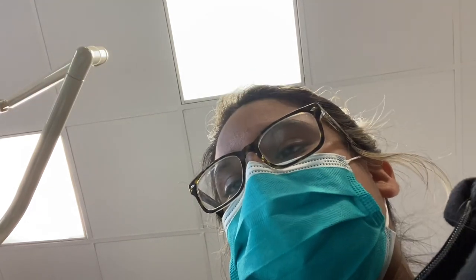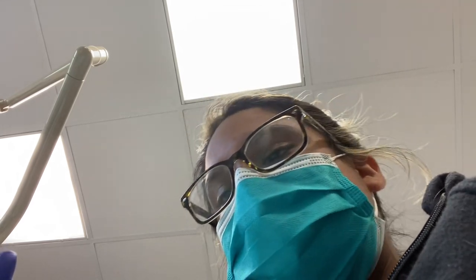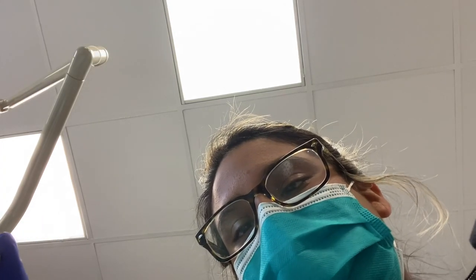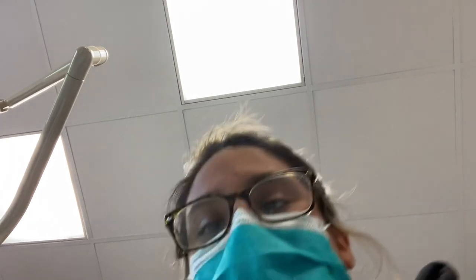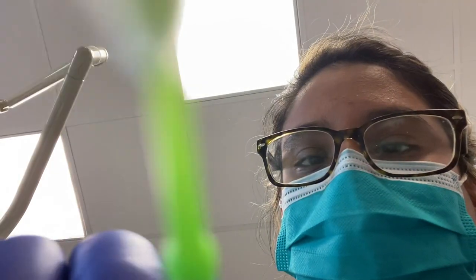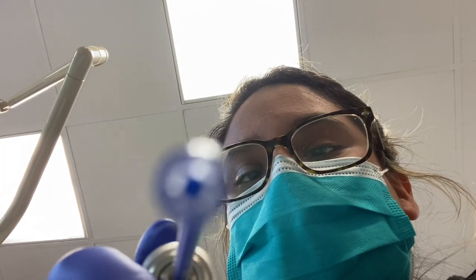And then I am going to rinse it out. Okay. Perfect. Now I'm just going to keep it nice and dry. Perfect. And now let me just get a little bonding resin there. Perfect. And then I'm just going to dry again. Perfect.